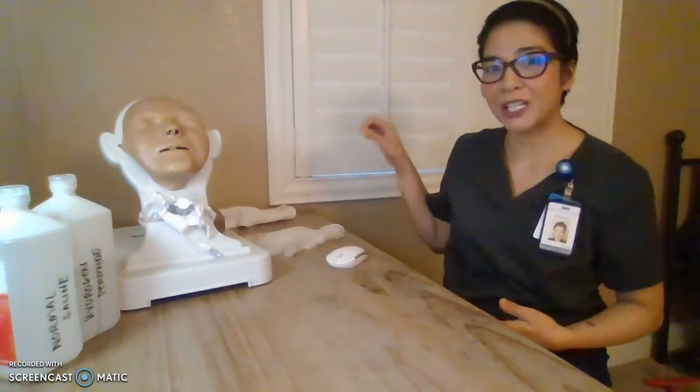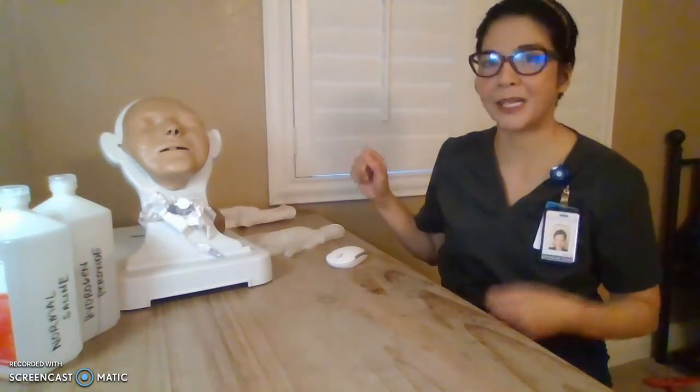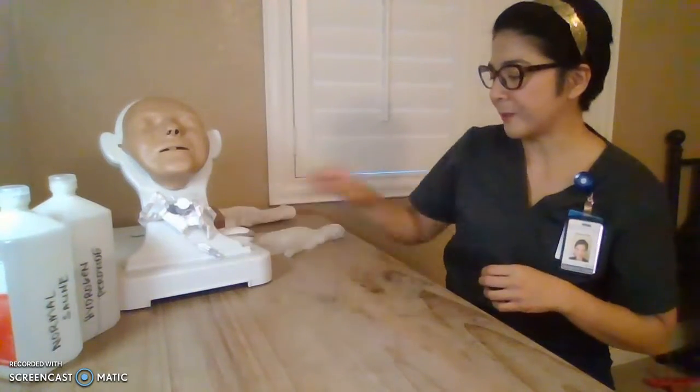Okay, so anything below your waist is not considered sterile, so have a trash bin nearby where you can just drop your dirty supplies in. Okay, so now let's start.